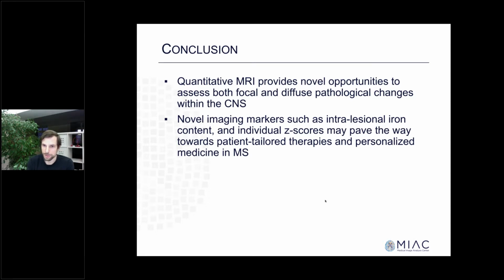That's a very important question, which is not fully solved yet. In theory, and that's the promise developers make, they should be comparable, because in theory you measure a true physical variable unit. But I'm not really convinced of that. There are for sure variabilities depending on the protocol and scanner, which I think we don't understand so well at the moment, and so you need a database in the background that has different scanners and different protocols for comparison.